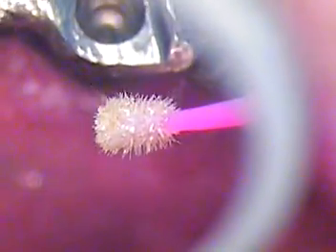Now this is the key. When you bring your tartar and stain in here, you go around in circles with this. Take a good look at the bristles on your brush, because that'll tell you if you're successful in removing anything from the threads. Because let's face it, you can't really see the threads sideways. You're just trusting that you're getting what's in there out and cleaning it thoroughly. So take a good look at that, and you can see there's plenty on that brush.